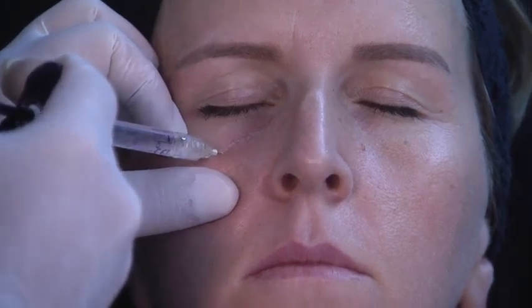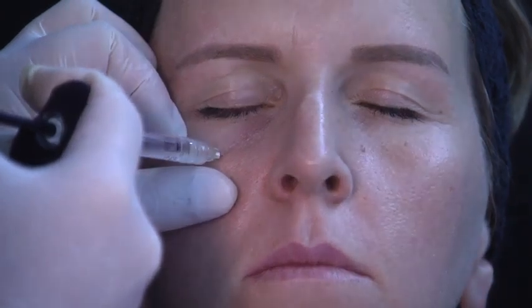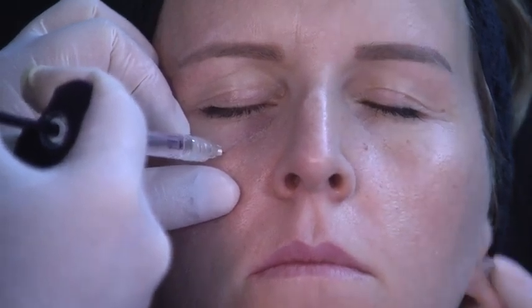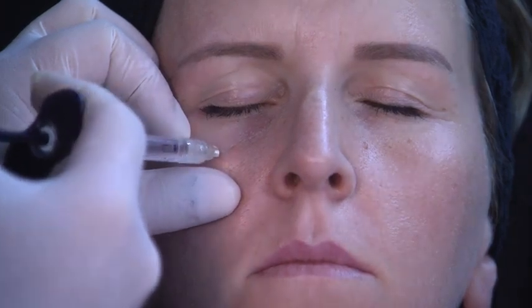Right, I'm going perpendicular on bone. I touch the bone, and what I'm going to do is a small deposit of 0.15. Oh my God, only 0.15. Can I have a gauge?